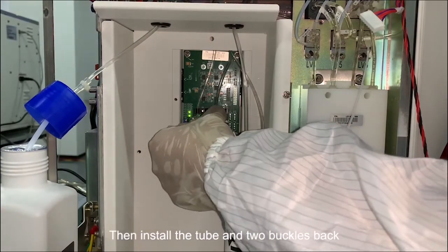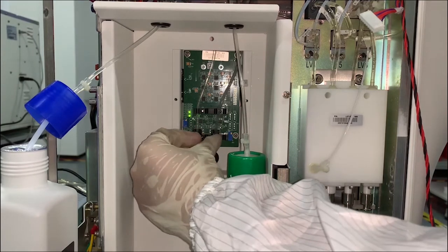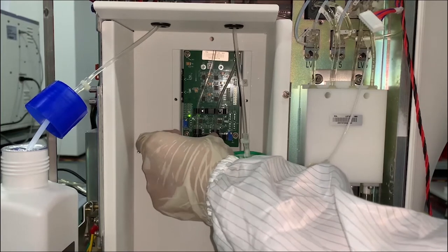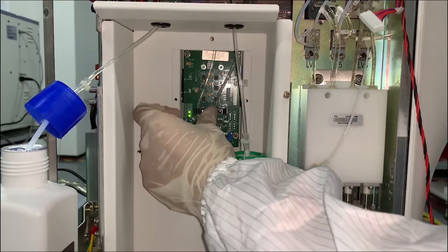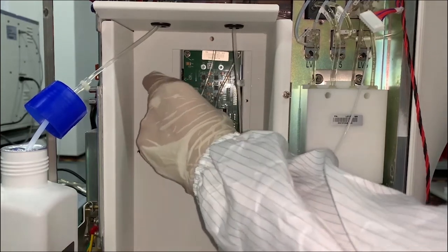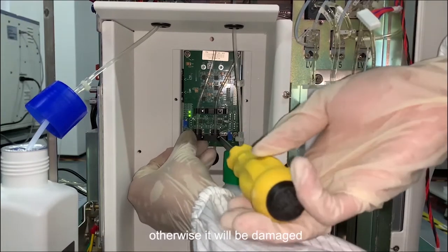Then install the tube and two buckles back. When you install the buckles, do not screw them too tight, otherwise they will be damaged.